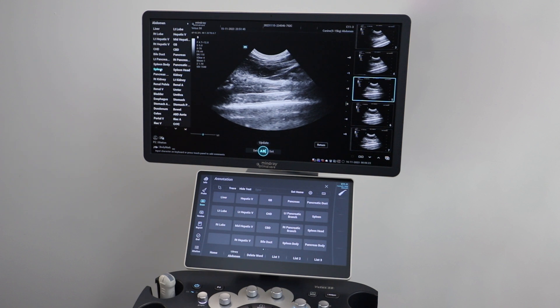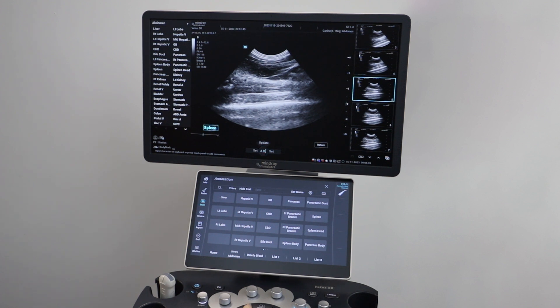When in yellow, the label is permanent, but if you would like to move it, hover the trackball cursor over the label until it turns blue. Click on it until a box surrounds it and then use the trackball cursor to move it to its desired spot.